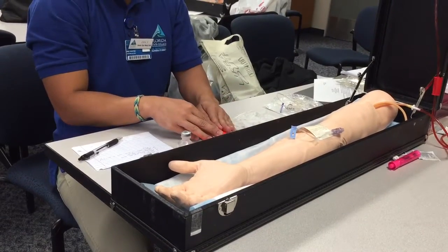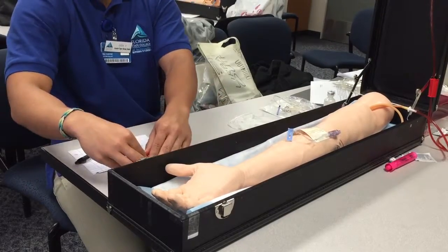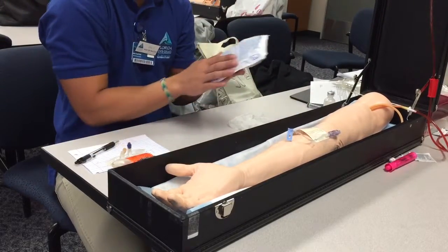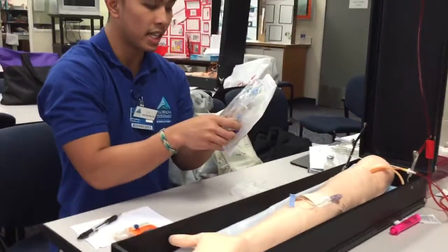So that would be good. Put that all over there. Then next you would want to prepare your tubing. This tubing is the tubing that we're going to use. It is 10 drops per milliliter. So I'm going to go ahead and take this out.